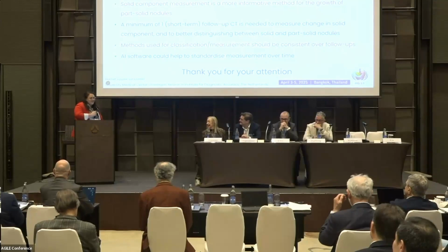That's a very good question. So the software, if I remember correctly, was minus 188 Hounsfield units. But again, this differs greatly. If I try to look back on this, what is the range of what we're using? That's very difficult to find, because it's very difficult for people to determine where they want to set that, and they also relate it to the other tissue of that participant themselves. So that's something we need to be really standardizing. Where are we setting that threshold, and can we say that it's going to be the same for every individual going forward?